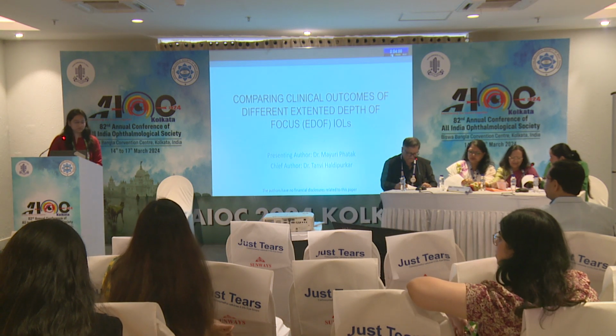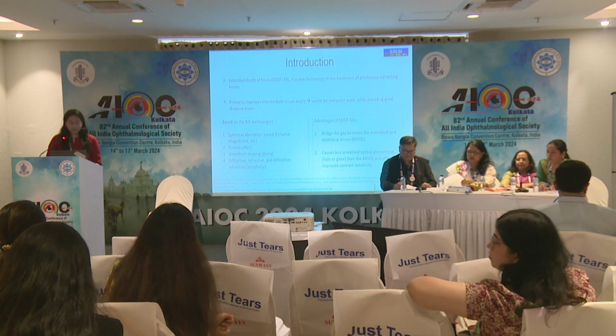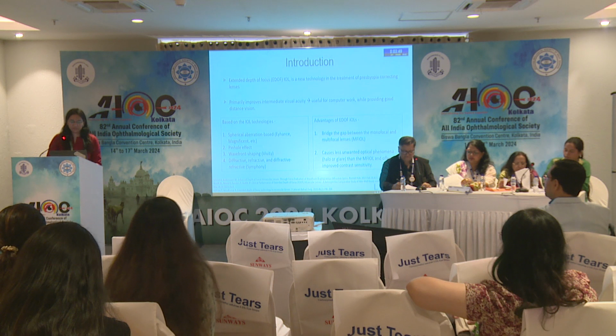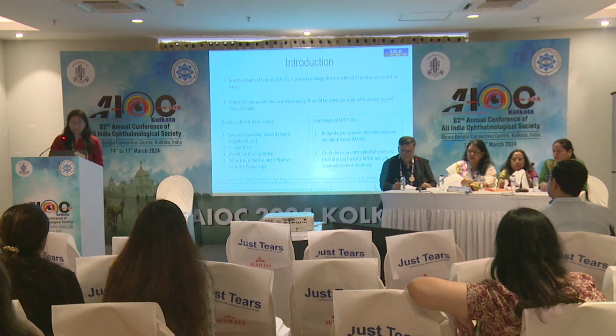Good morning to all. My topic for today is comparing clinical outcomes of different EDOF IOLs. EDOF IOL is a new technology in treatment of presbyopia correcting lenses, and it primarily improves intermediate visual acuity, which is useful for computer work, while providing good distance vision.